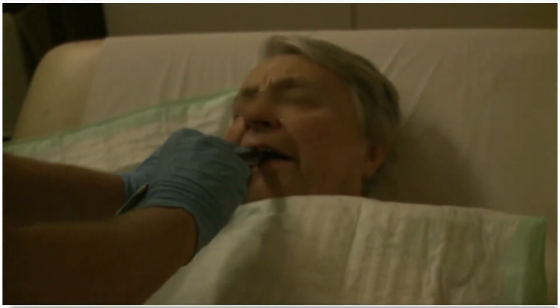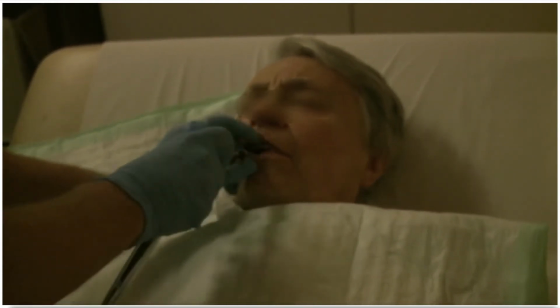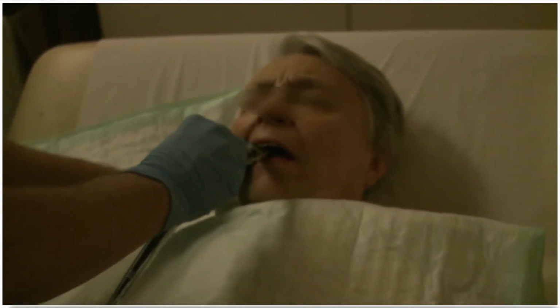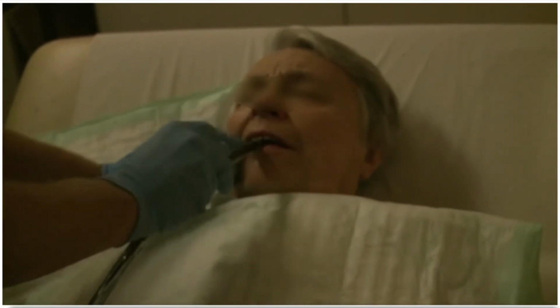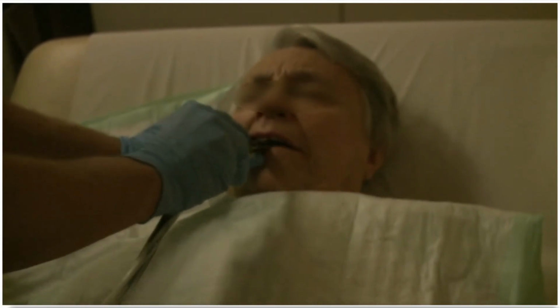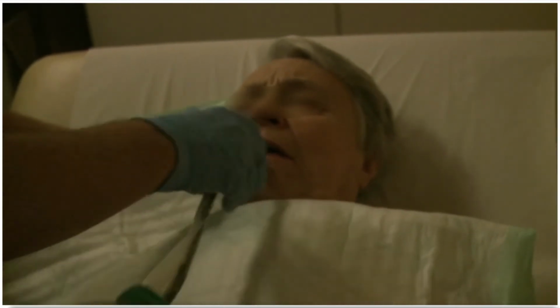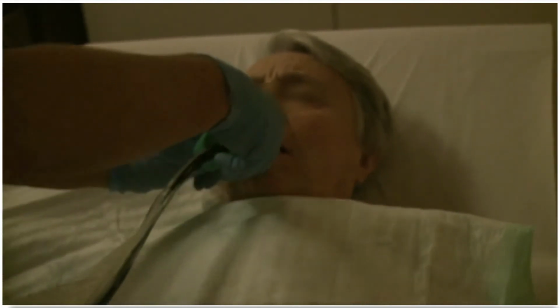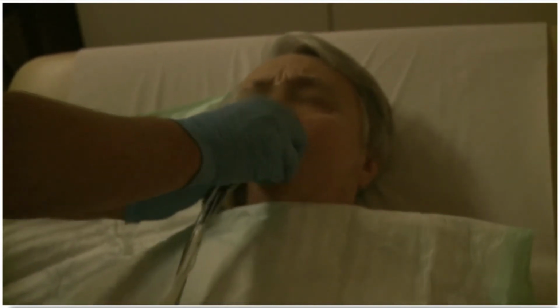The patient is in a slight left lateral position. You usually feel when the resistance is gone when you're in the esophagus. Now, this is the phase which is probably the most uncomfortable for the patient. Once the probe is swallowed, it's easier for them. Never apply too much pressure, because obviously this is what really can cause complications.